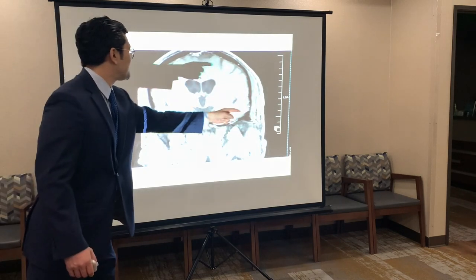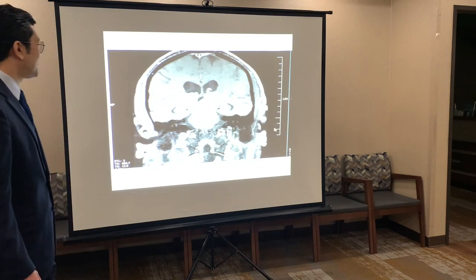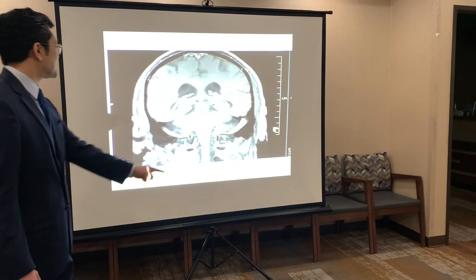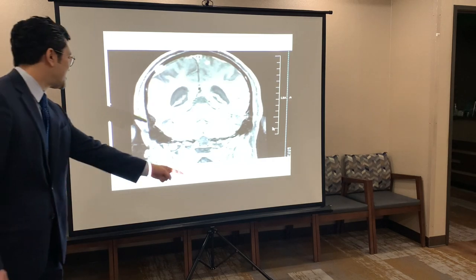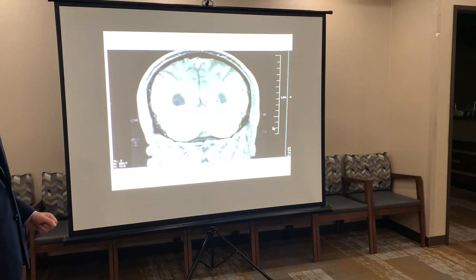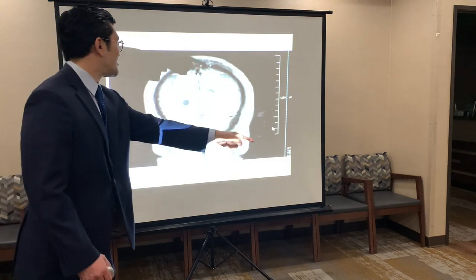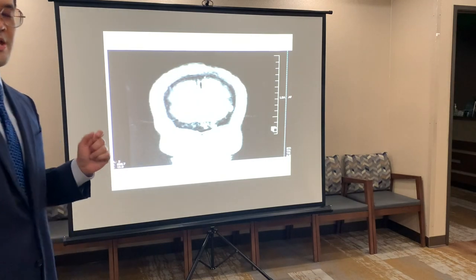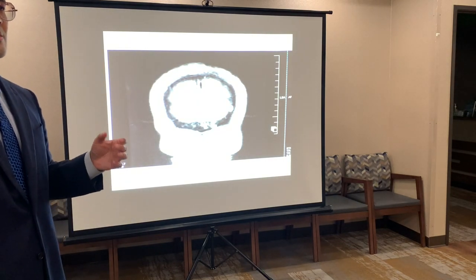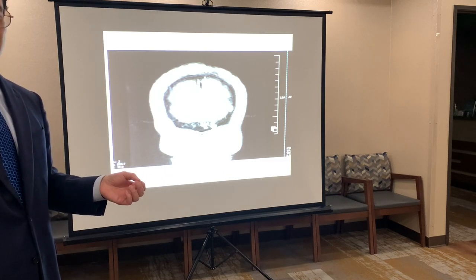Look at that, there's another one. There's another one right here. There's another one right there in the brainstem. There's another one right here. There's another one right there, and another one up there. So the head imaging revealed multiple metastases inside the brain.